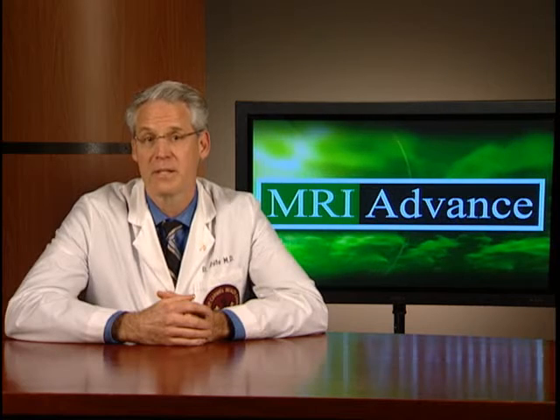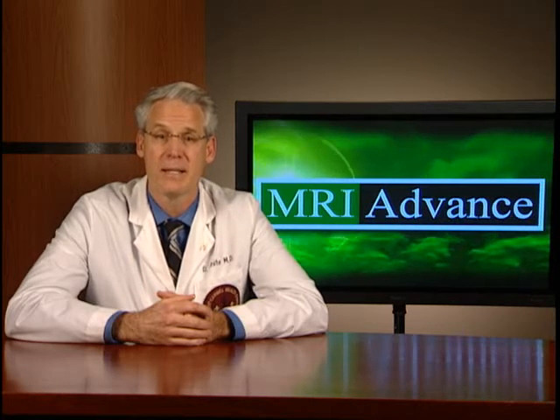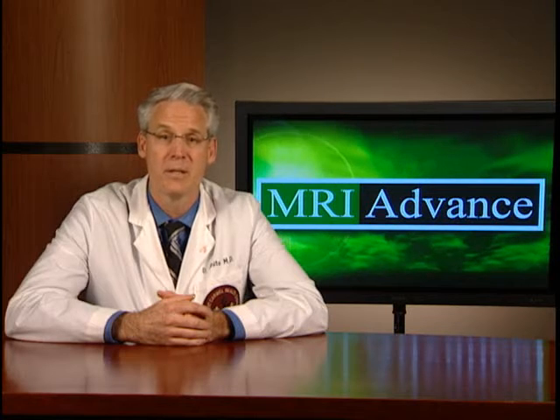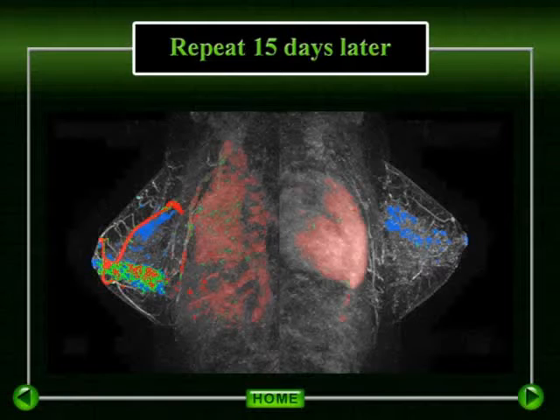We initially began funneling the scheduling of our exams through our lead technologist, but then this was expanded as additional technologists were trained. We have found this system to be much more effective in guaranteeing appropriate scheduling of our breast MRI patients. When unique circumstances are presented, the technologists know at that time to consult with the radiologist in making final determinations. Failing to have a specialized means of scheduling significantly increases the chance of both performing inappropriate breast MRI exams as well as being put in the position of imaging patients at an inappropriate time of their cycle or in other situations which can often lead to suboptimal imaging results.